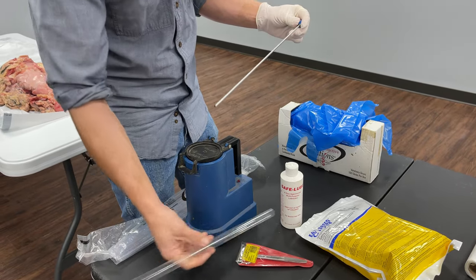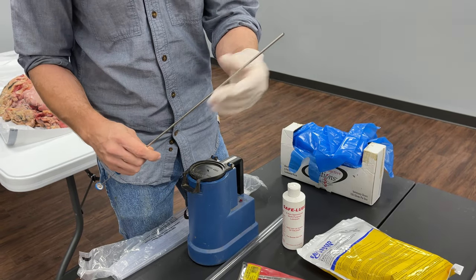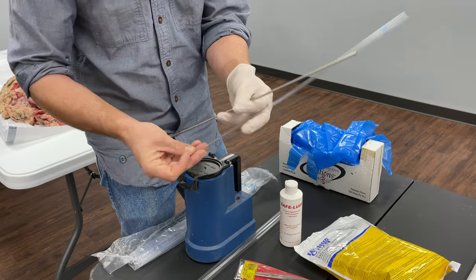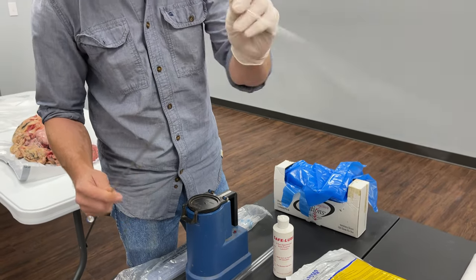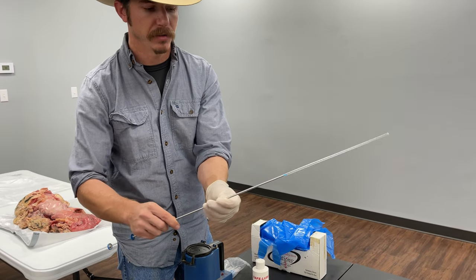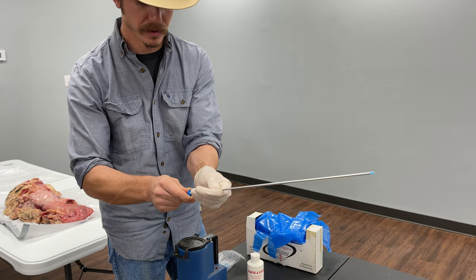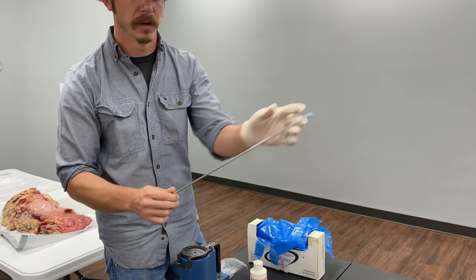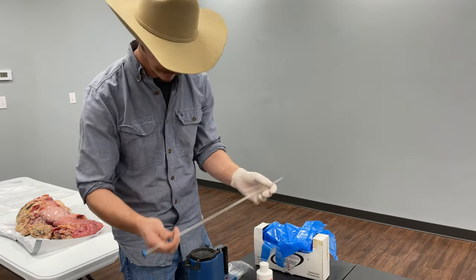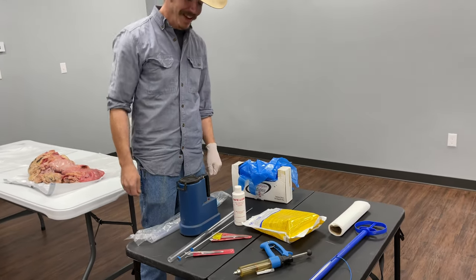This is a breeding gun. You pull the plunger back, insert the straw in the end, and these are sheaths right here. Make sure the blue end goes on first so it can be pushed to the end. You shove the little blue piece all the way to the end, and there's a catch that holds it on securely. That's after the straw is put in and cut off — that's what we use to breed.